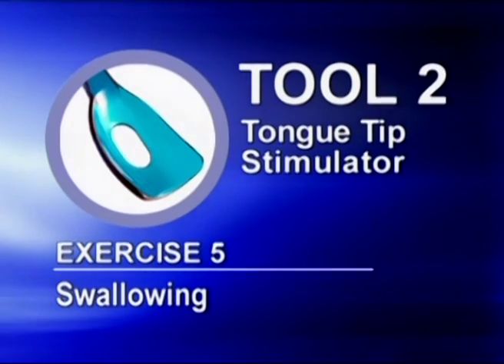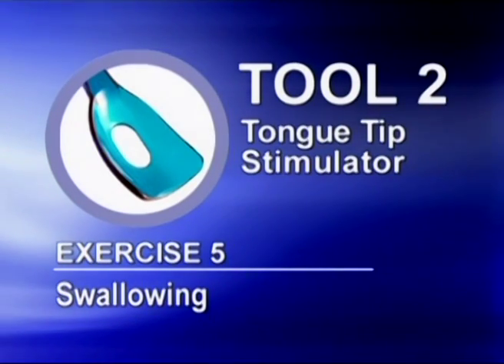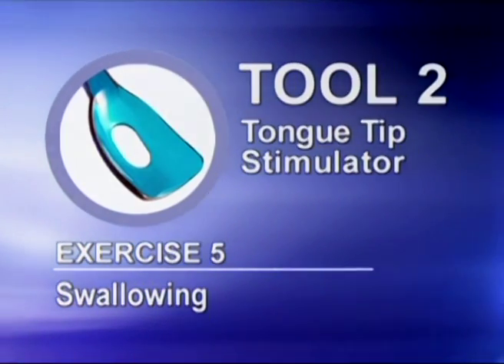The goal of exercise protocol 5 is accuracy of swallowing. Use water to moisten the mouth. Place tool number 2 on the palate behind the front teeth. Elevate the tongue tip into the hole opening. Bite teeth on the handle. Swallow.